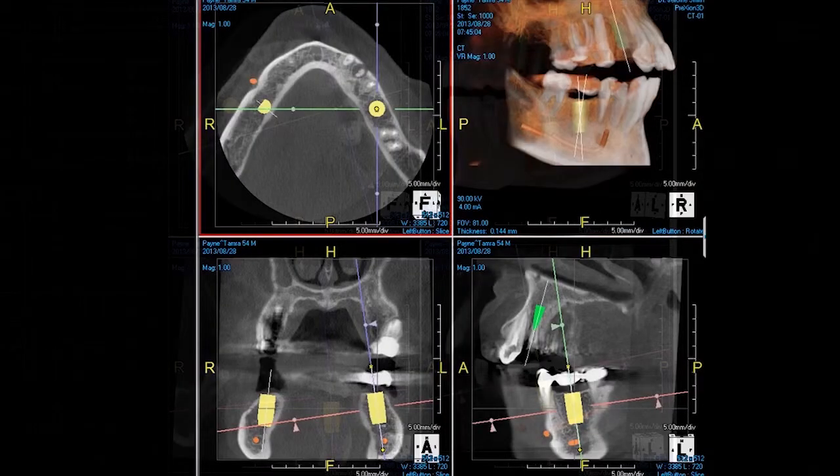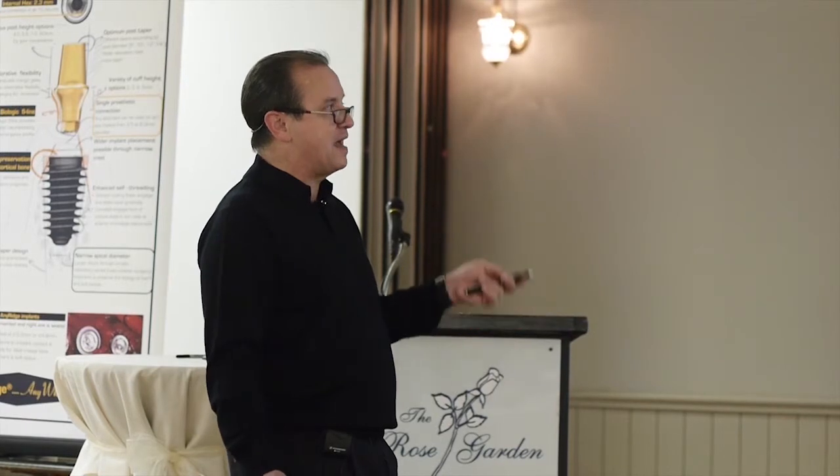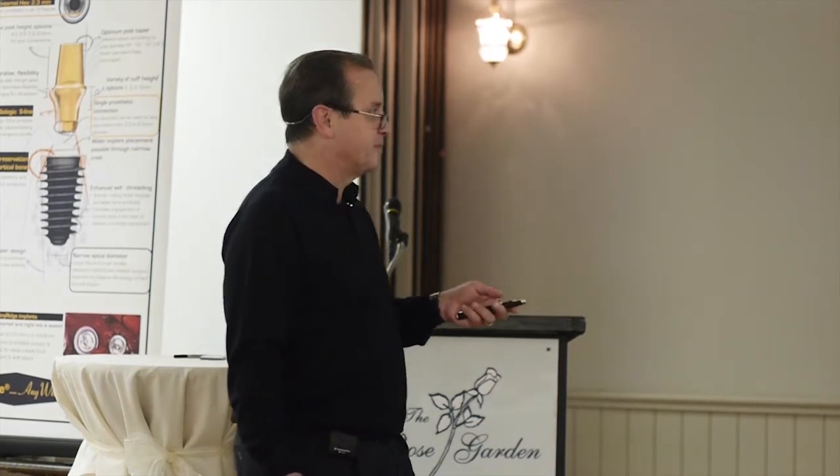But basically, we're going to show a patient a scan and where we're thinking about placing our implants. Ahead of time, we already know what diameter we think we're going to use, what length we think we're going to use, and the scan just gives us all of that information. And this is just before simulation of what her smile could look like after. And we do this on a lot of patients just to give an idea where we're headed.